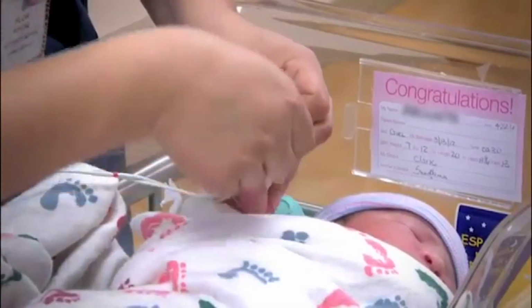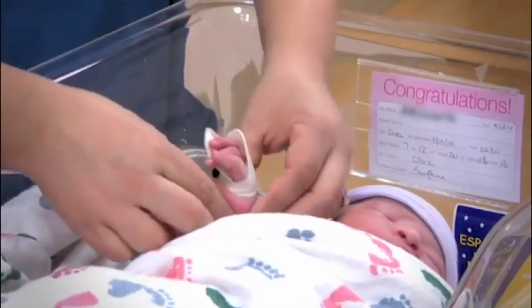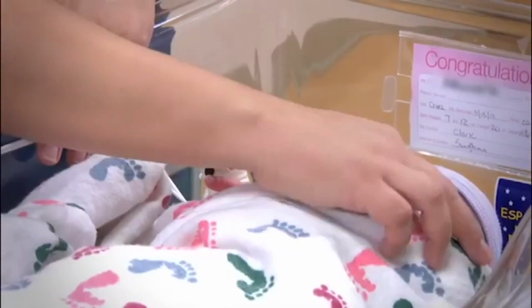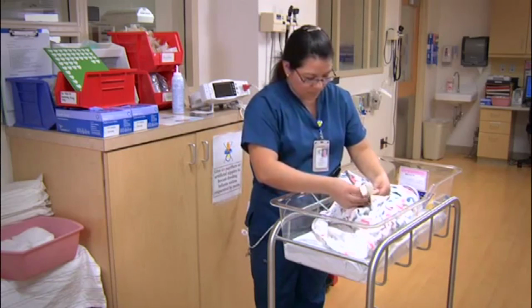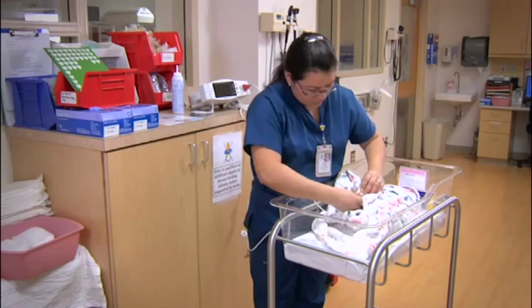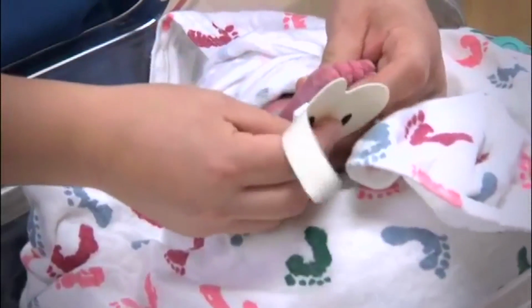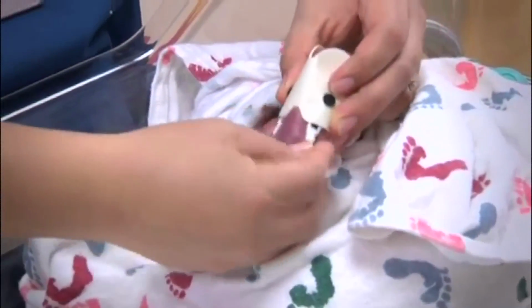The best sites for performing pulse ox on infants are around the palm and the foot. Substances with dark pigmentation, such as dried blood on the skin, can affect the pulse ox reading. Make sure skin is clean and dry before placing the sensor on the infant. Skin color and jaundice usually don't affect the pulse ox reading. An infant pulse ox sensor, not an adult pulse ox clip, should always be used for infants.